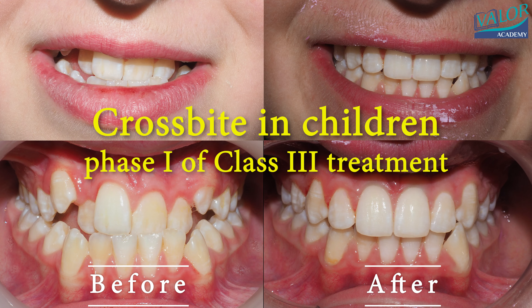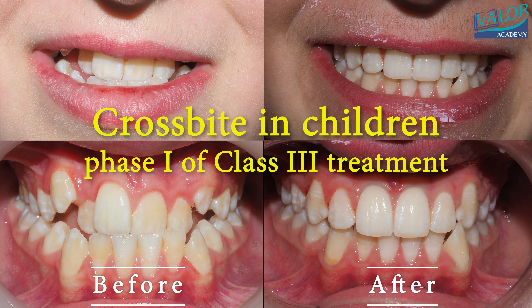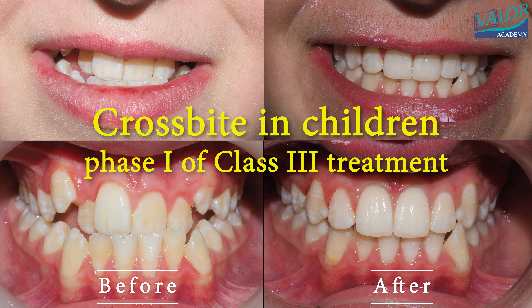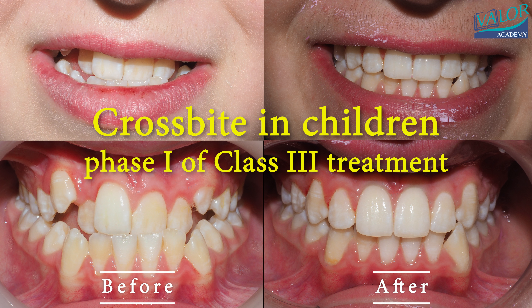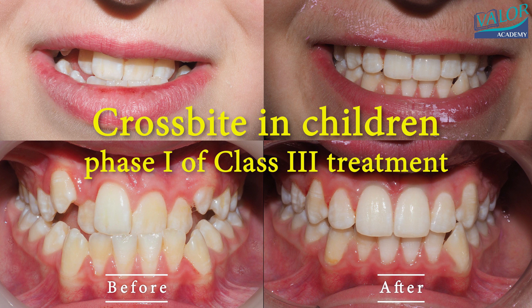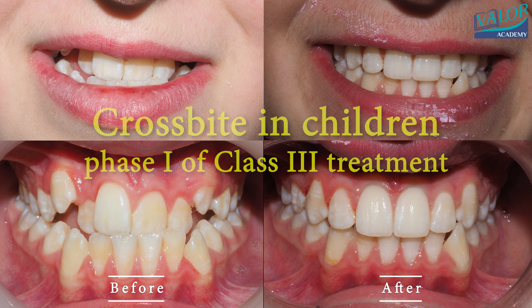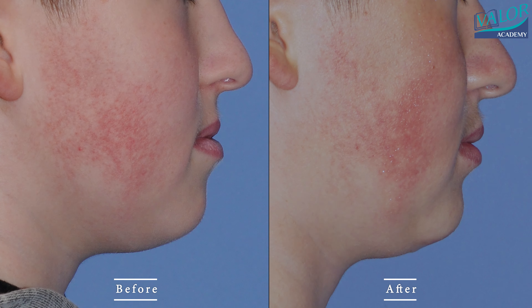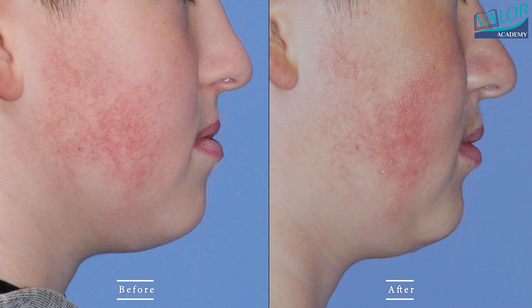In this video, we present an early treatment approach for a Class III patient. As you can see, the lower lip is quite prominent.